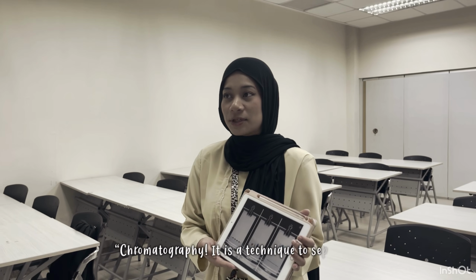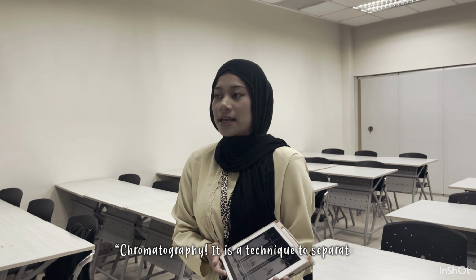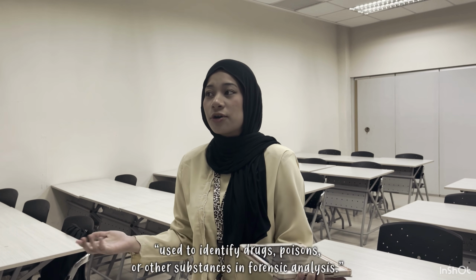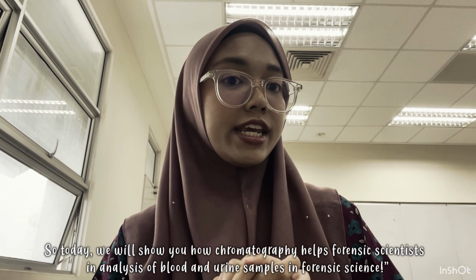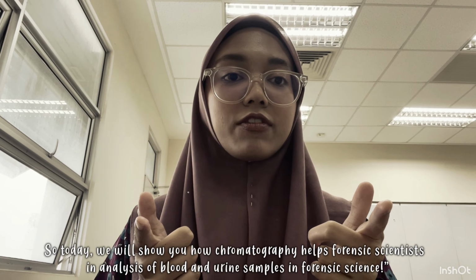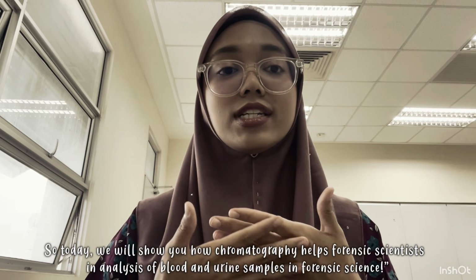What? Chromatography. It is a technique to separate different chemicals in the sample, used to identify drugs, poison, or other substances in forensic analysis. So today, we will show you how chromatography helps forensic scientists in analysis of blood and urine samples in forensic science.